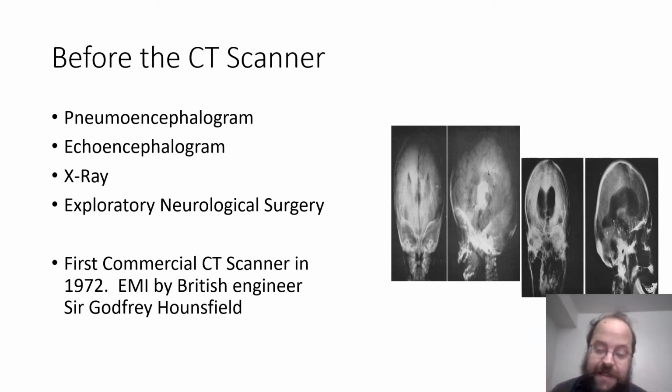Problem is, obviously, often there was a lot of fatality because you'd have infection, there wasn't the controls, and so obviously a different solution was necessary. And so Sir Godfrey Hounsfield, I'm not sure if I'm pronouncing that right, a British engineer for the company EMI, developed the first CAT scanner.